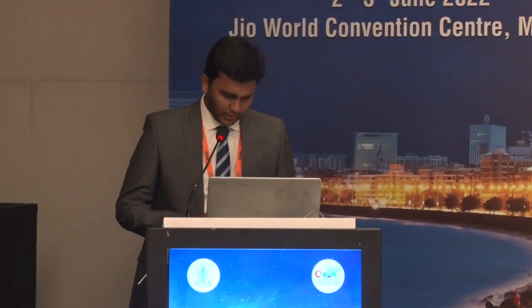Thank you everyone. I'll be speaking about the results of the novel CMT flex lens in comparison with the standard scleral fixated lens and the iris claw lens. I have no financial disclosures, whereas my good friend Dr. Nivian is the innovator and the patent holder for this lens. So a little background about the subject. We know that when there is a posterior capsular compromise, surgeons fall back on two standard options, that is the scleral fixated IOL or the iris claw lens.